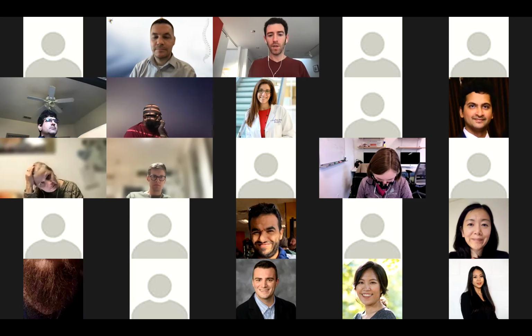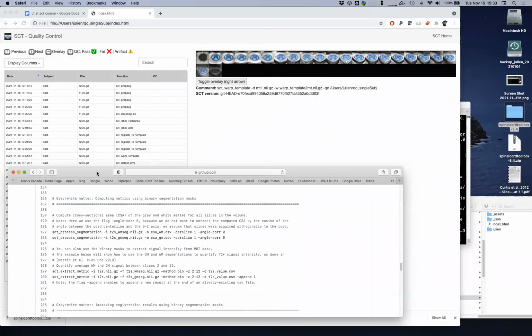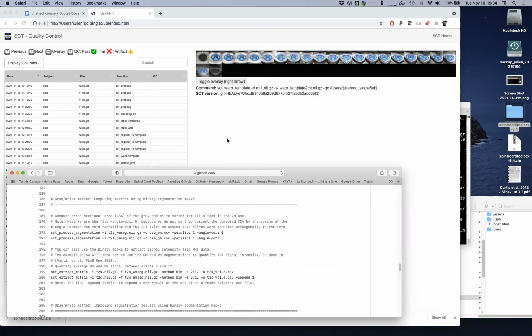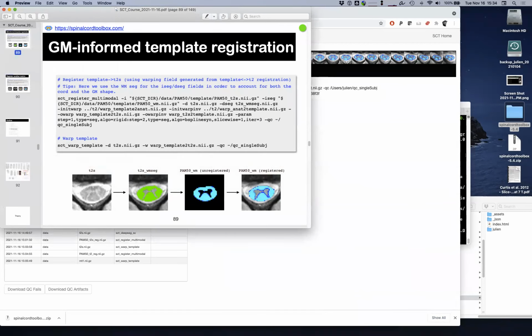Let's share the screen. Good. Okay, is there any question from the audience until then?